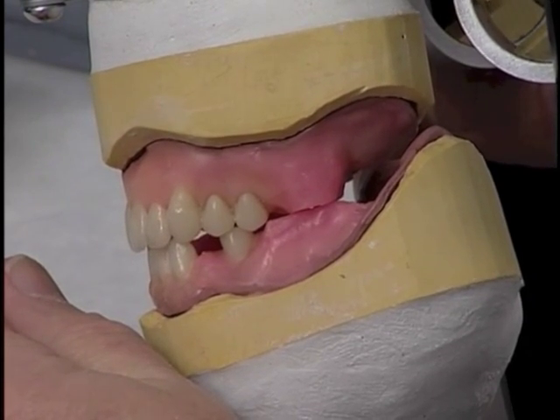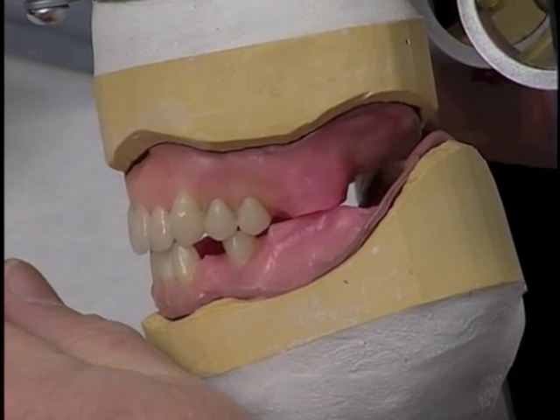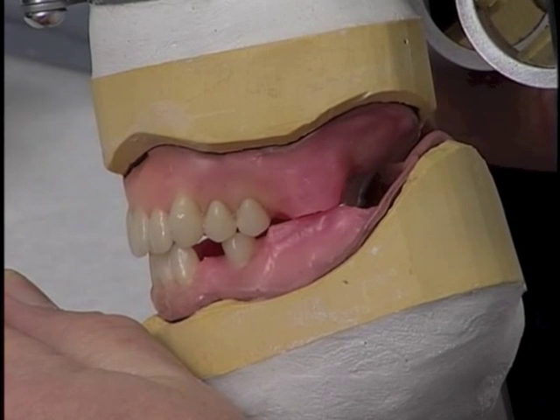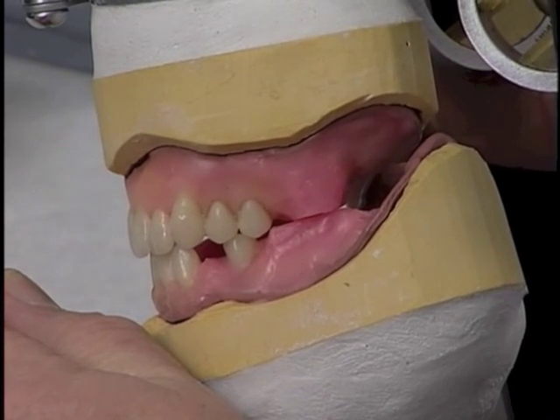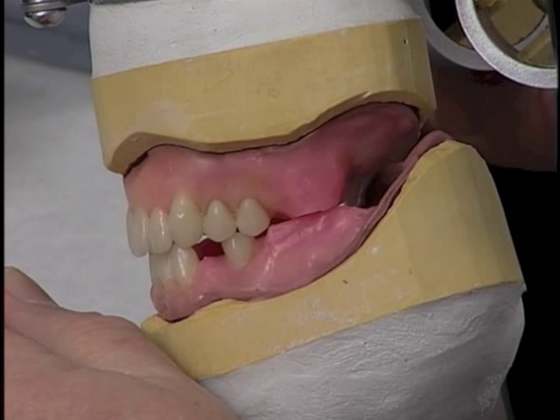And when that mandibular second premolar is in its correct position, we can see in centric relation that we have a good solid cusp fossa relationship of the mandibular buccal cusp into the fossa created by the triangular fossa of the maxillary 2 premolars.